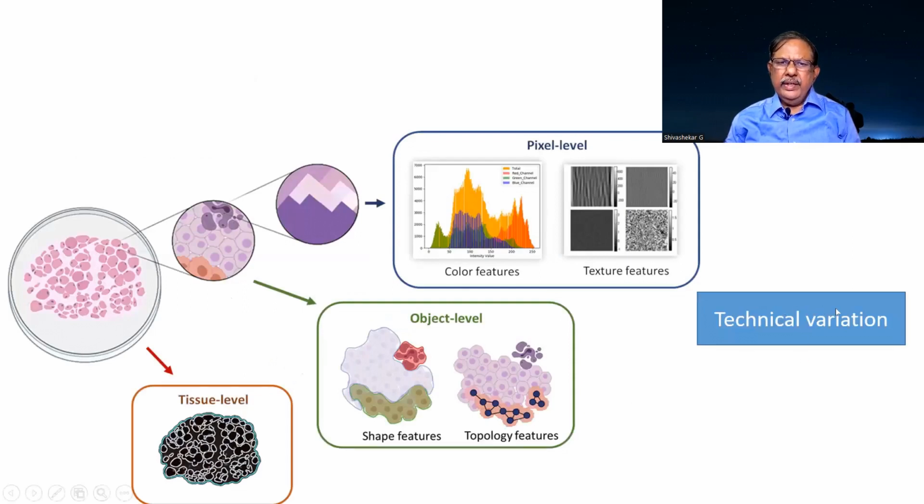So there can be a technical variation. This is a little complex, but just see what is happening over here. So this is a slide in which the tissue is over here. The various components such as the size, the design, the intensity are all being taken into account. And finally, the area that is being focused is being picturized. And there are different features of it which could be studied, which gives an image which can be in the graphic form also for them to study.